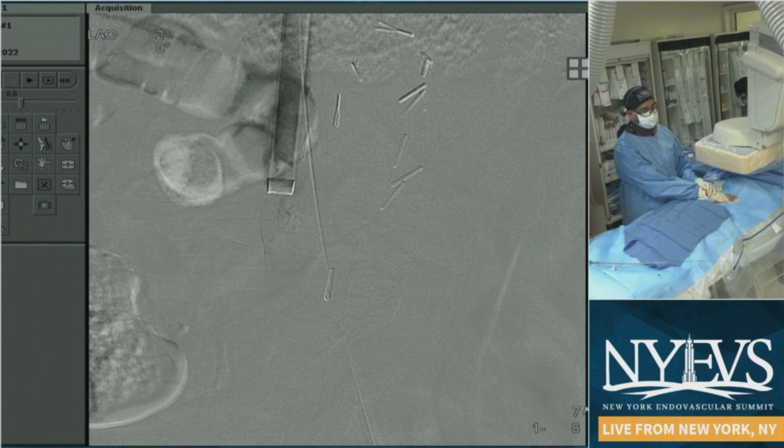I just have a question for the panelists and also for Rahul. This particular case didn't require quite a lot of manipulation, but let's say it did with the forceps, and then the post retrieval cavogram was fine. Are you or any other panelists putting these patients on anticoagulation for a short period of time to prevent any thrombus on the extraction site?